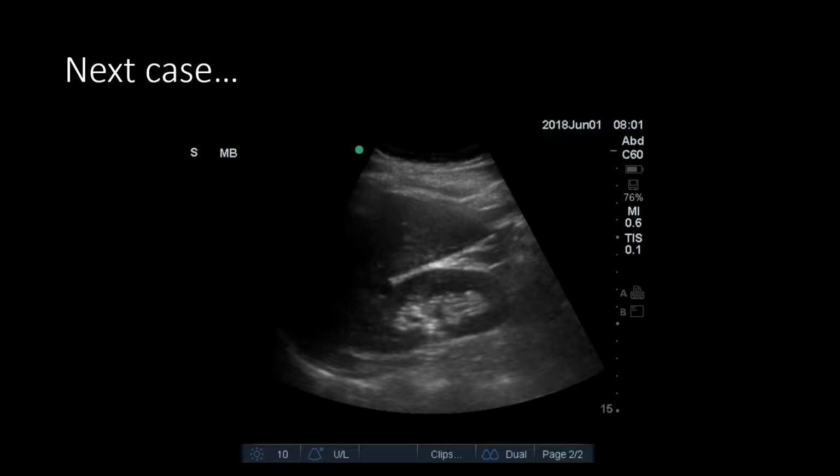But now EDE has added one more prognostic data point to say that it's reasonable not to push things further. Maybe the patient does not need that CT scan. Maybe that patient does not need urology follow-up. After all, the patient himself knows it's a kidney stone. He just wanted to get his pain under control and to get a prescription. He's likely a patient who is willing to come back to see you in a few days if his pain is not better. But probably it will be better.